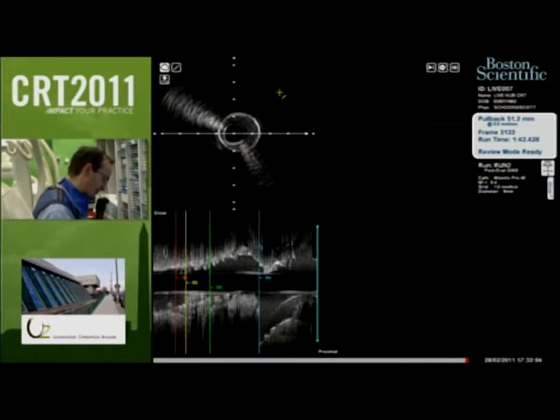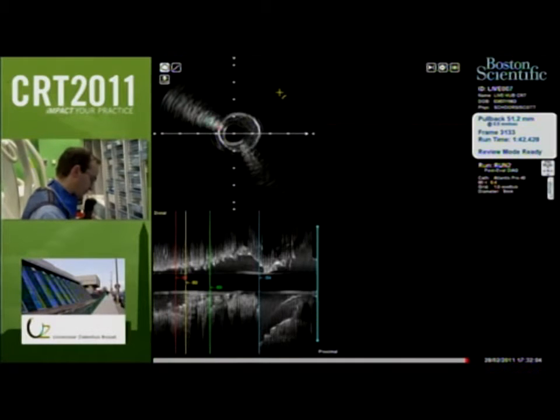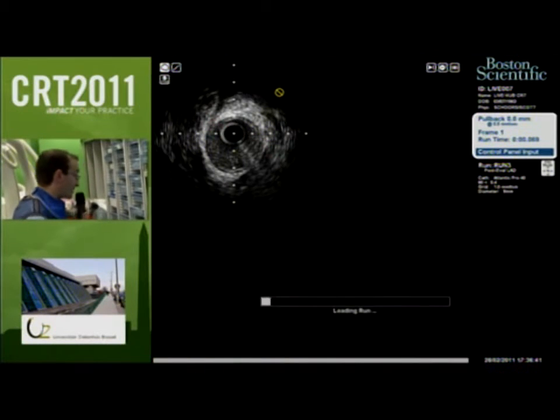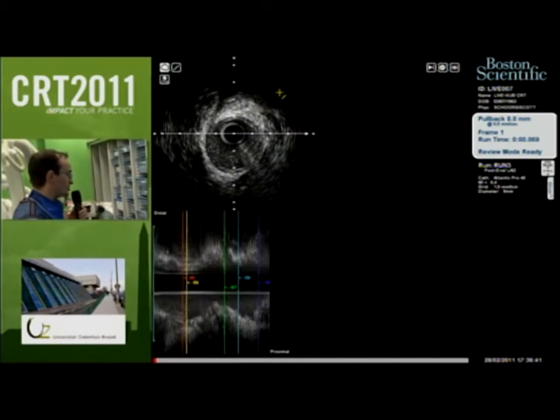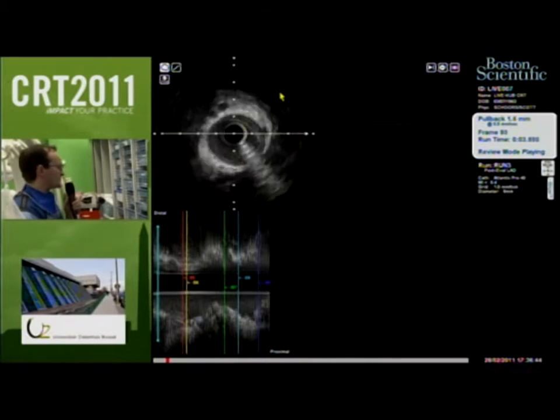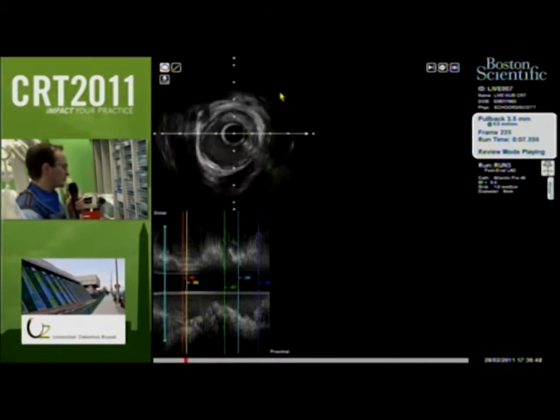I think that after the post-dilatation in the diagonal, we just went for one run in the LAD, and angiographically the diagonal was looking good, and you will appreciate on this pullback now the distal LAD that was with some pinching from, I think, a short myocardial bridging at this level.